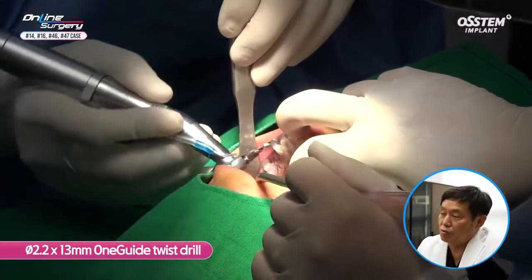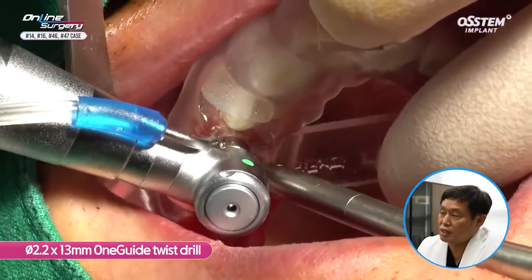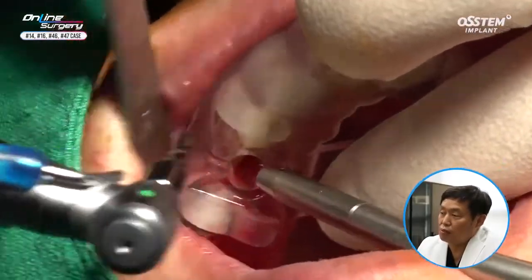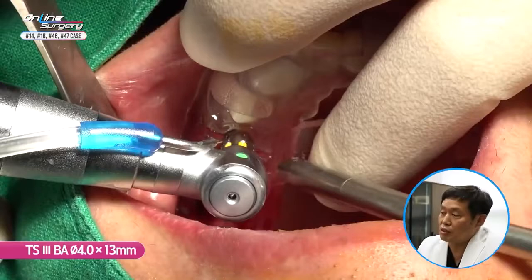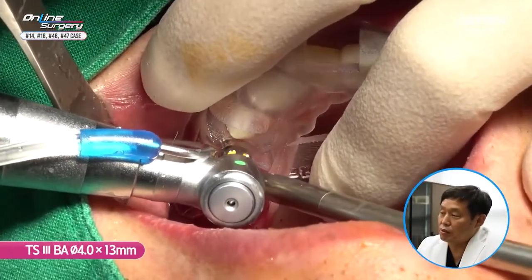Final drill is the same. It's the same as placing 3.5 diameter implant. 2.2 by 13 millimeter twisted drill is used. Implants are being placed. As if placing 3.5, 4.0 has been placed.